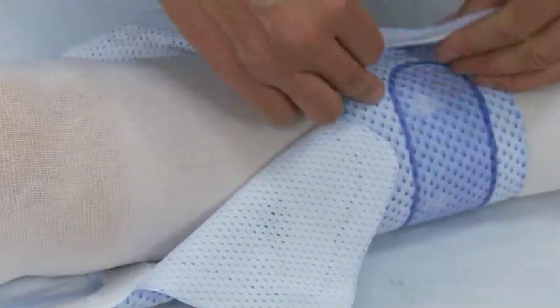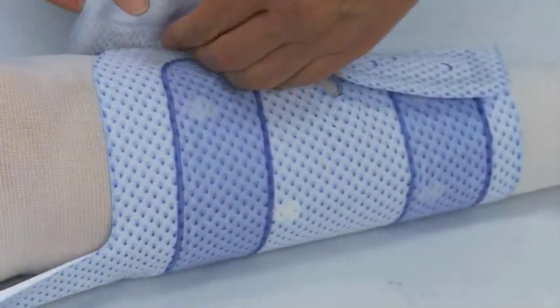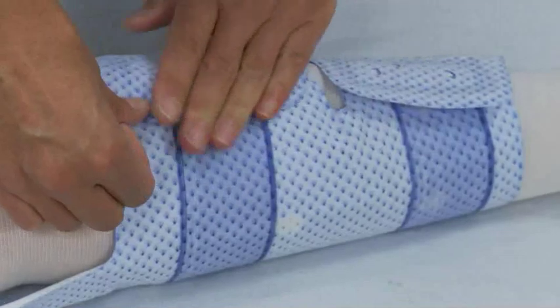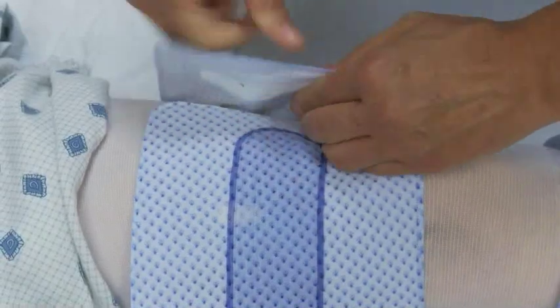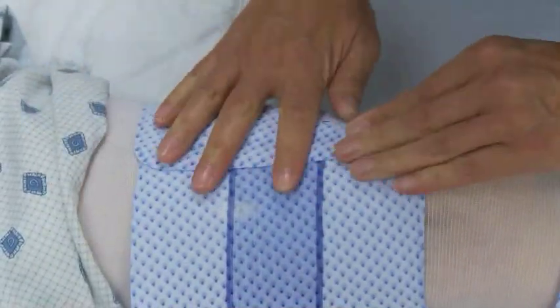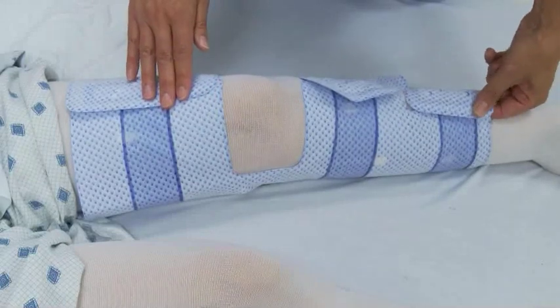Holding the ankle section of the sleeve against the patient's ankle, wrap the sleeve securely around the ankle and calf, attaching the hook edge securely to the sleeve. If thigh length is being used, repeat this procedure on the thigh section of the sleeve. The sleeve should fit securely but not tightly around all sections of the leg.